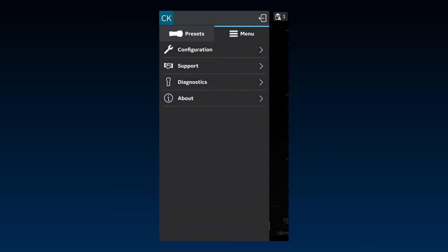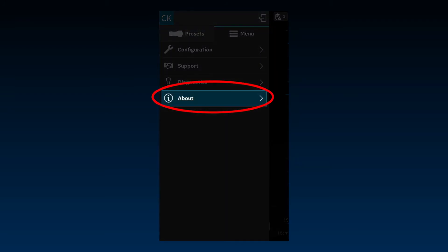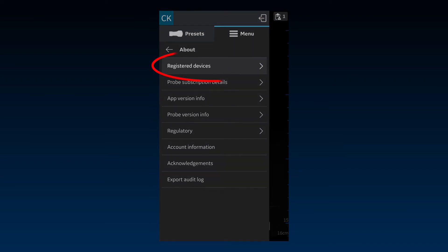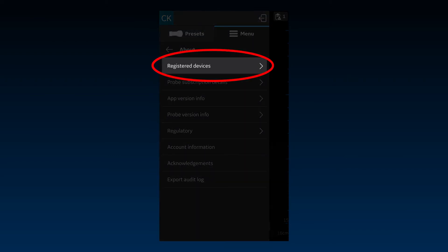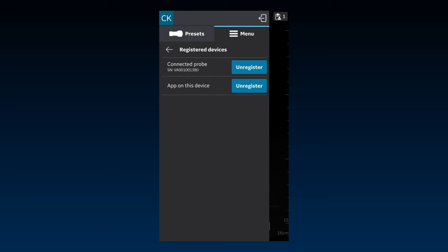You can unregister a connected probe or the app through the menu. Click on Menu, About, and Registered Devices to see the connected probe you wish to unregister. Please ensure you are connected to the network when unregistering a probe. Note, if you are using probes owned by your organization, they may be fleet-enabled probes. These probes can only be unregistered by an administrator.